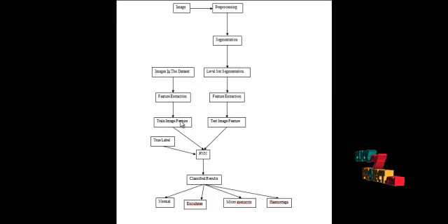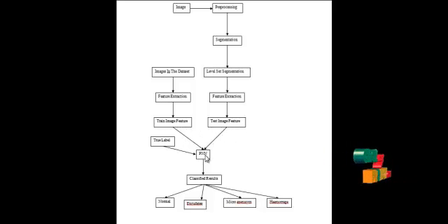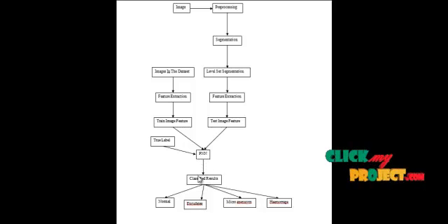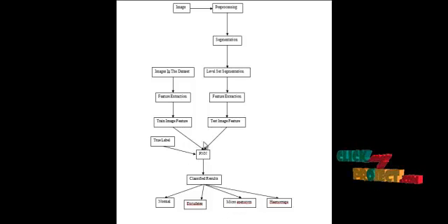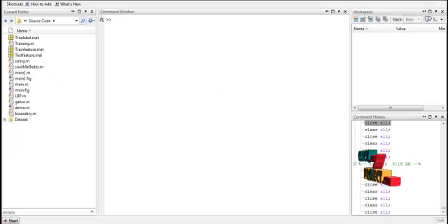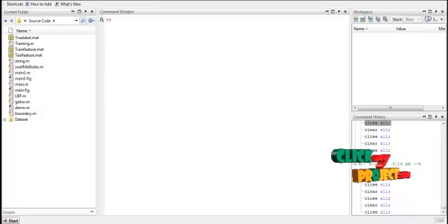Similarly, we are training the features. These features were combined and given to the probabilistic neural network. The probabilistic neural network classifies the input retinal image into normal, exudate, hemorrhage, or micro-aneurysm. So we are identifying four types of defects in the retinal images.